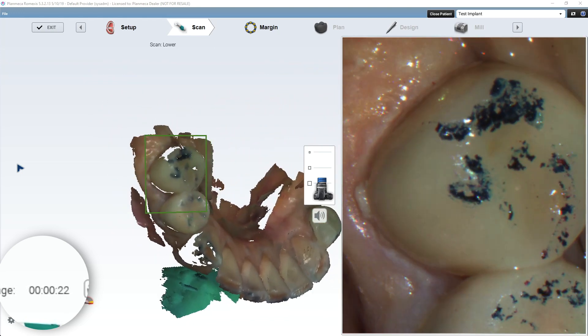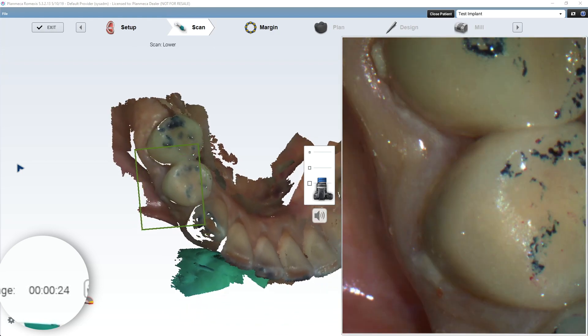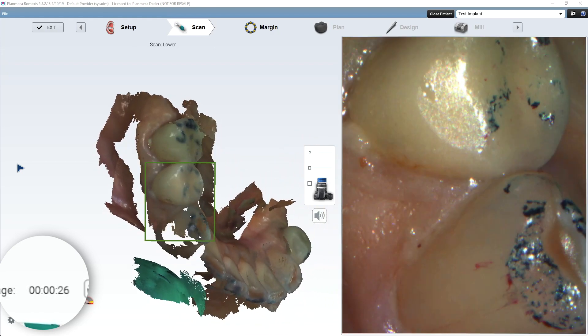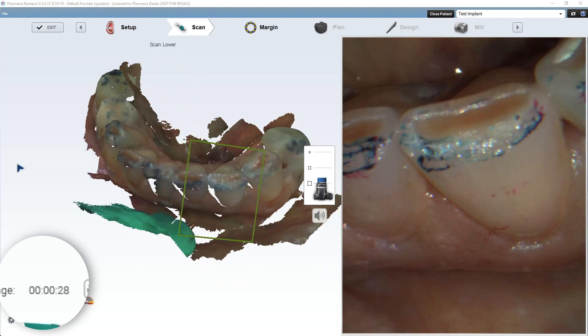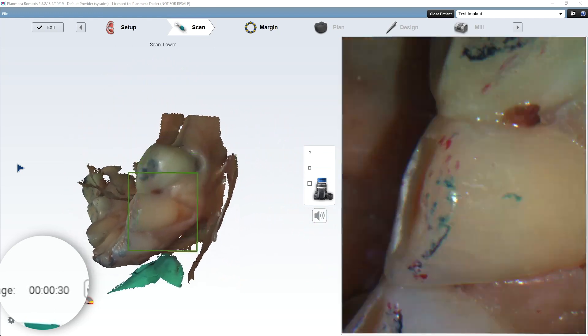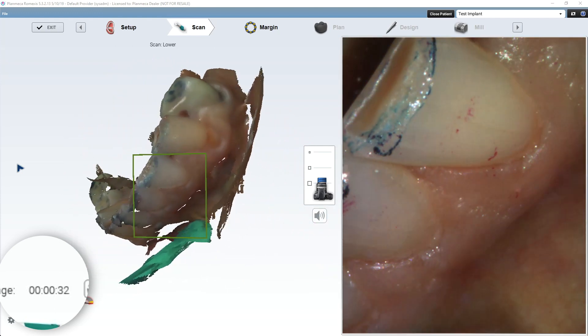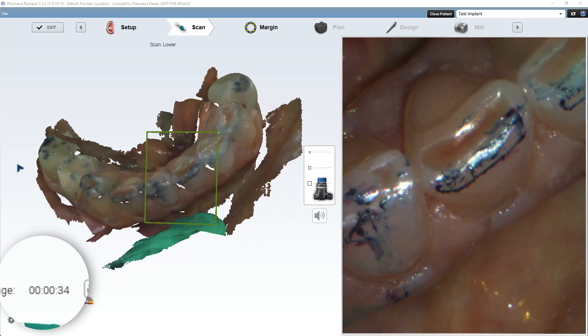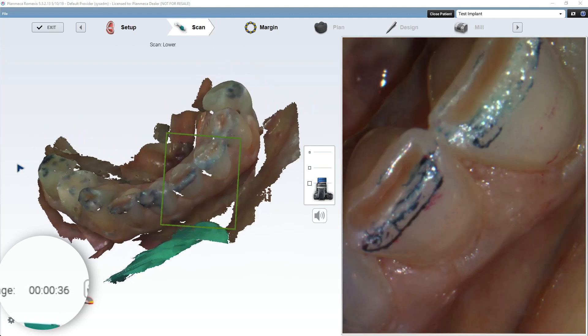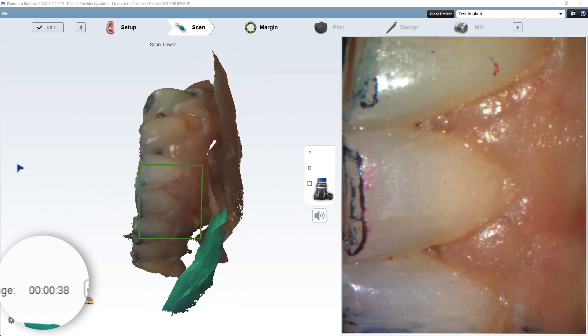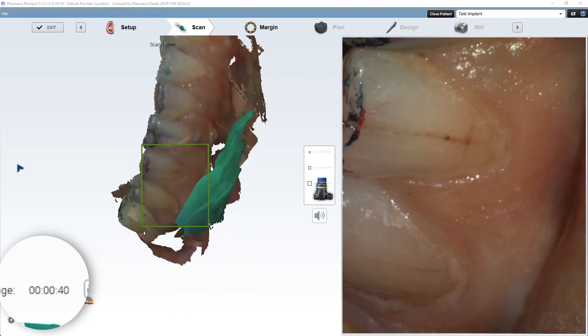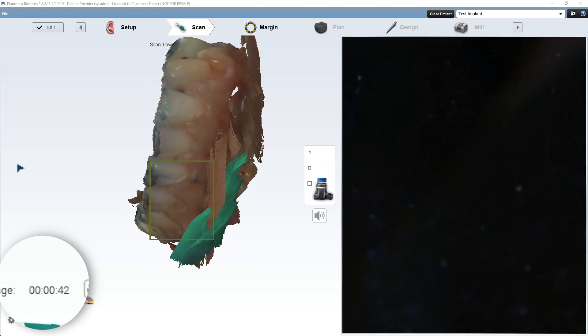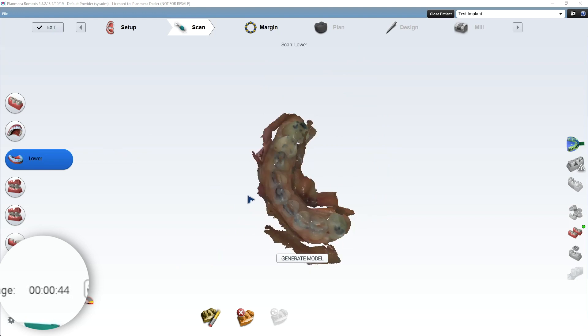Now I'm scanning that. Now I will say, Planmeca is working on something called global alignment, which is really going to help with scan bodies in particular. We sometimes do struggle scanning large scan body cases with this. But I want to show you the workflow because I think it's important to see. So now we have the lower. And now we're going to go ahead and render that model.